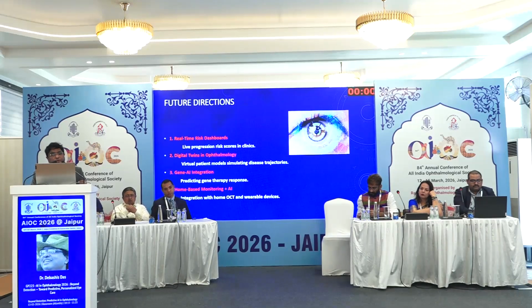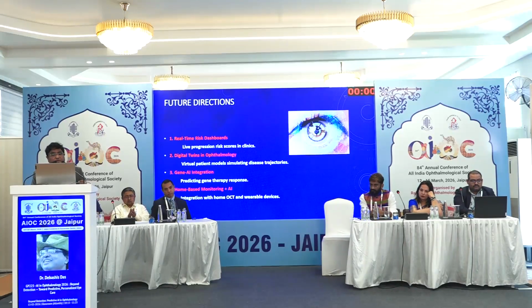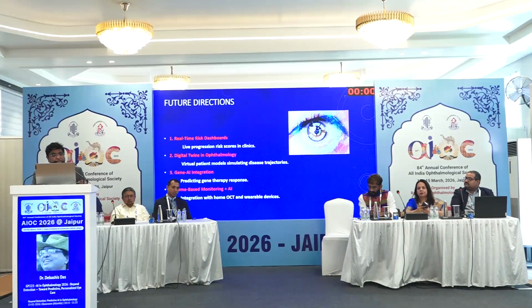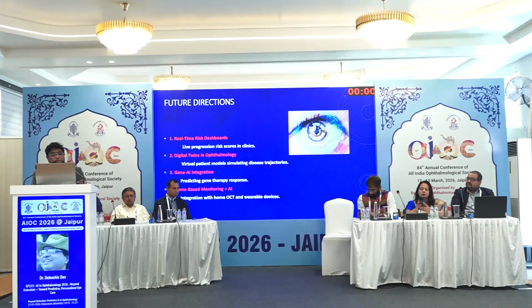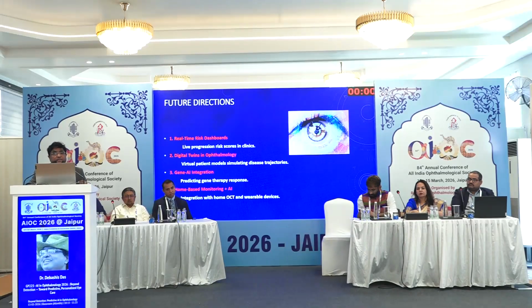Real-time risk dashboard, live progression risk scores for each patient will be available in the clinics. Digital twins in ophthalmology, virtual patient models simulating disease trajectories. Gene AI integration, predicting gene therapy response. And home-based monitoring with AI, integration of the home OCT and wearable devices.